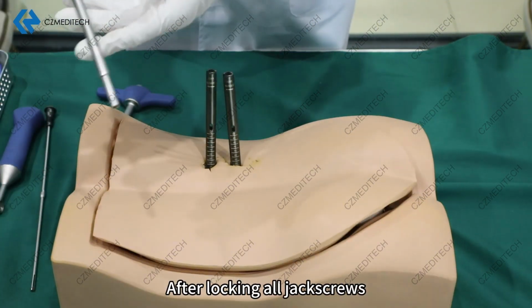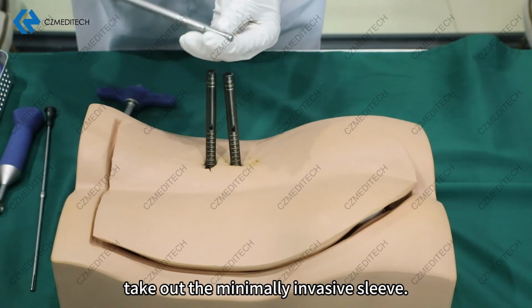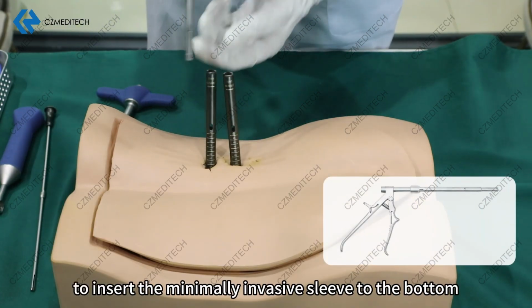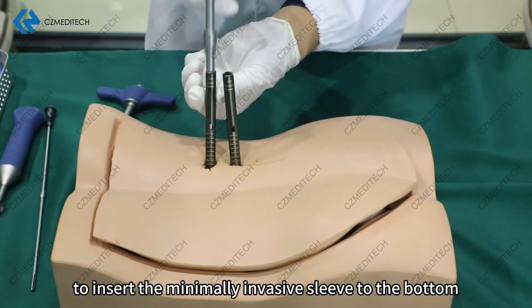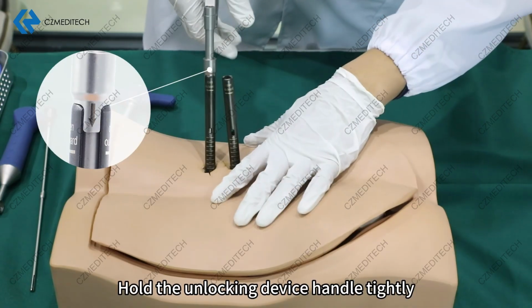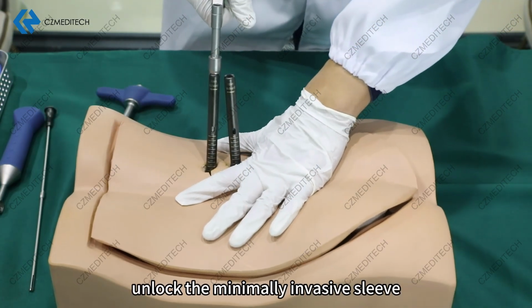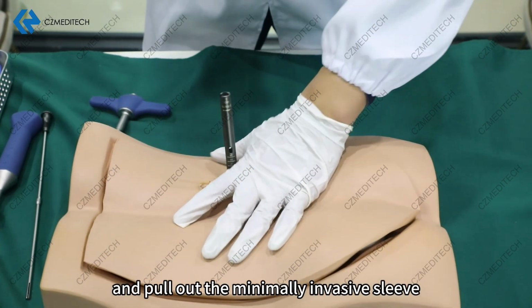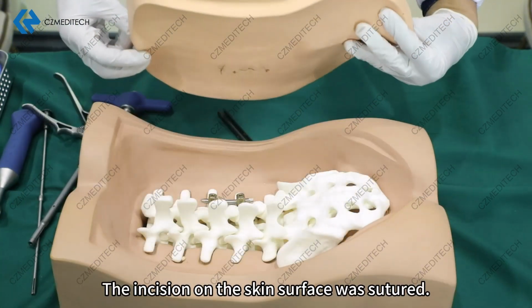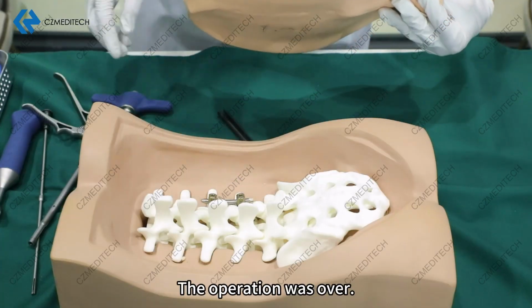After locking all jack screws, take out the minimally invasive sleeve. Use the minimally invasive sleeve unloader to insert to the bottom of the minimally invasive sleeve. Hold the unlocking device handle tightly. Unlock the minimally invasive sleeve and pull out the minimally invasive sleeve in the direction of the outside. The incision on the skin surface was sutured. The operation was over.